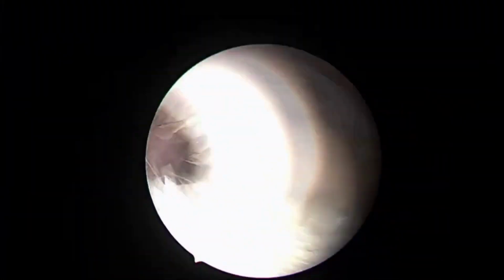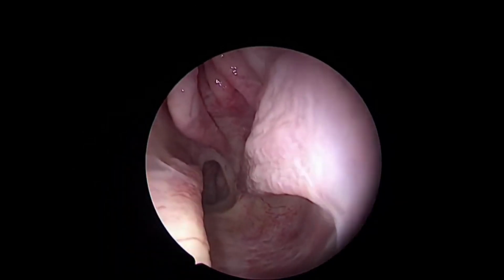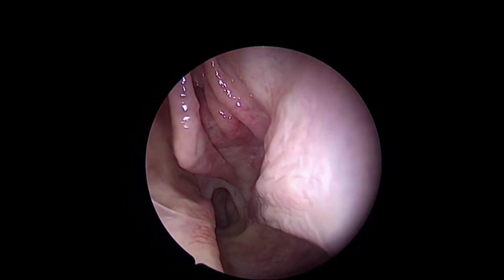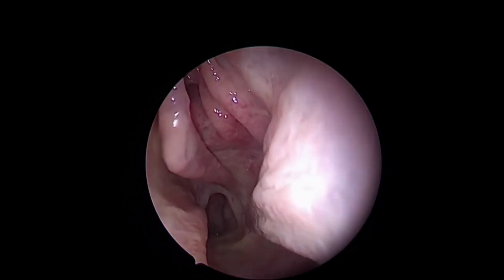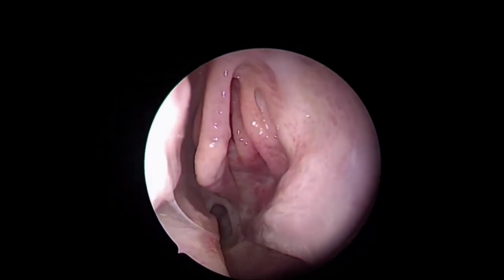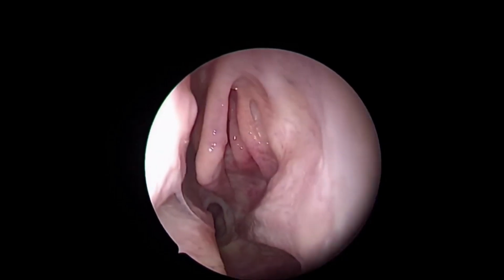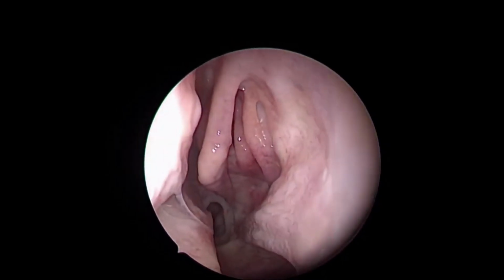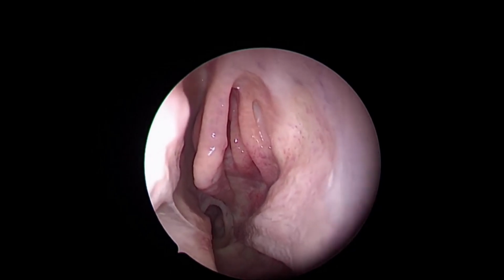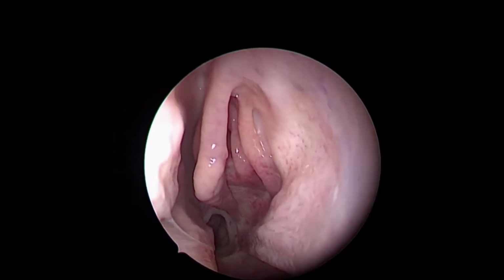Our plan is, as we said, we'll start with the basics with the endonasal anatomy, dissection of paranasal sinuses. We have discussed a lot in the previous webinars and the live surgical sessions, but cadaver is something special where you can show more and more procedures in a less period of time. So we'll be showing all the approaches to each and every sinus, not only endoscopic, but whenever required, the open and the extended approaches as well, particularly the maxillary sinus.